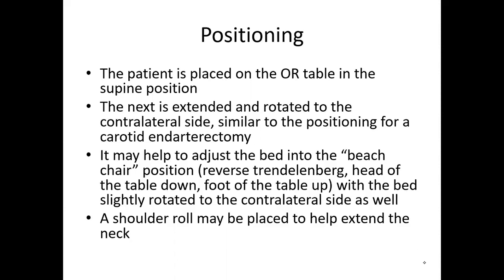And I usually put a shoulder roll underneath the patient's shoulders to get maximal extension. And if the head is floating a little bit, one of those gel donuts to support the back of the head. This should facilitate opening up that space, getting a lot of room to work at the base of the neck.